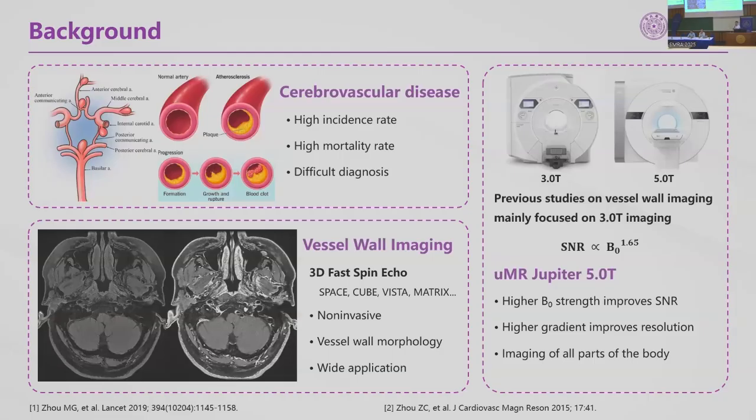First is the background of my study. Cerebrovascular diseases are characterized by high incidence, high mortality, and diagnostic challenges, posing a serious threat to human health. This makes accurate diagnosis of cerebrovascular disease especially critical. Magnetic resonance vessel imaging can non-invasively depict the morphological features of vessel walls.